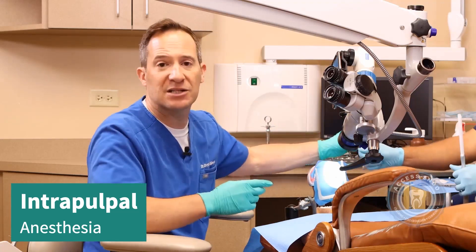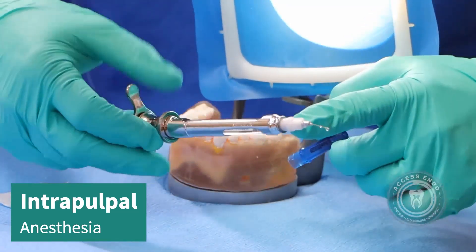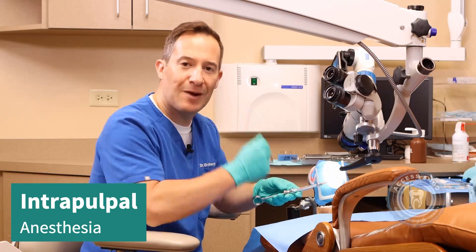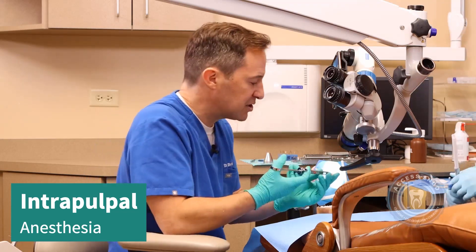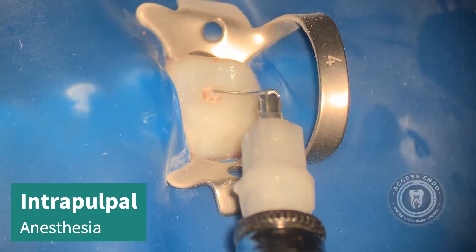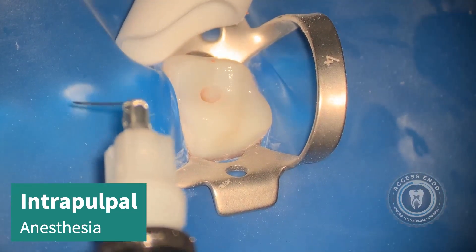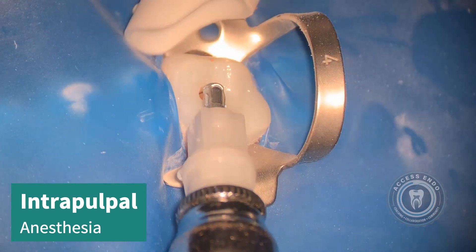I'm going to take care of that for you, and the way that we do that is with an intrapulpal injection. What I have here is a carpule of local anesthetic with a number 30 gauge short needle — this is going to be perfect for this. What I'm going to be doing is a pressurized injection. The injection is going to come under force directly into the pulp, and it will give a shockwave through that pulp and take away any more sensitivity. I'll tell the patient, okay ma'am, I'm going to place a little medicine into your tooth, so you're going to feel me for just a second. I sort of feel around and get it to fall into the chamber. I'm not quite there yet because I only have just that little penetration — just the size of the number four round burr so far — so I'm going to allow this to kind of penetrate. The patient might feel that just a touch, but typically not a lot.